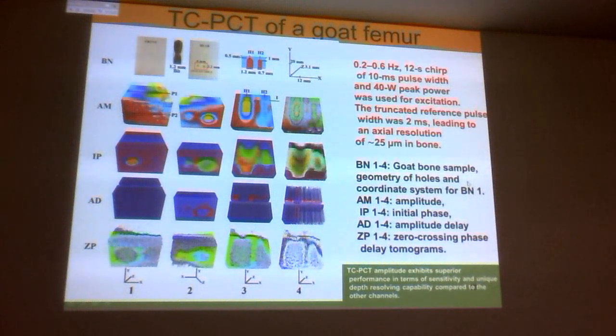Each one of them you delay by some amount. If you delay too much, then you start overlapping with the next. Each one of them, you're generating your pulse. It's a thermal pulse, so it's a thermal decay, so it's decaying. As it's decaying, you could overlap with the previous pulse, but you're putting your window right below the pulse here. So you delay your window to catch this decay time, this decay time, this decay time, and each one of them is localized because it picks up the heat within that time interval.